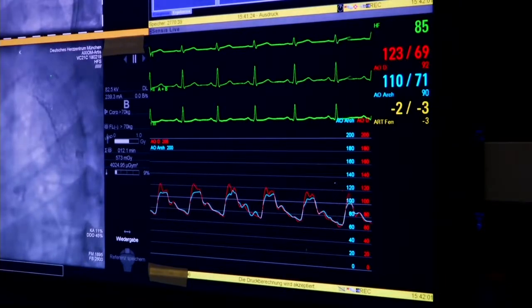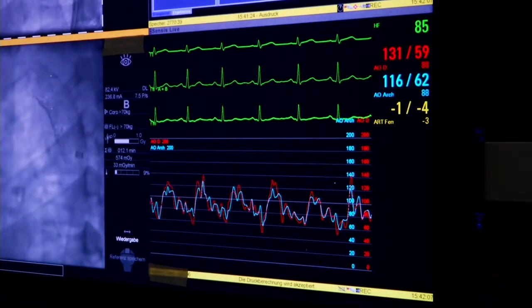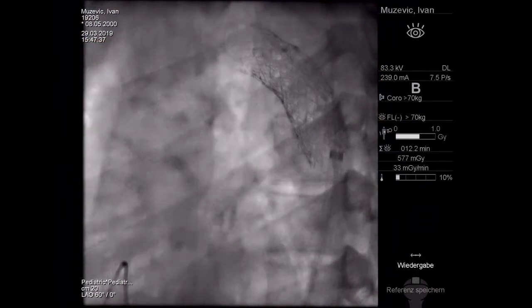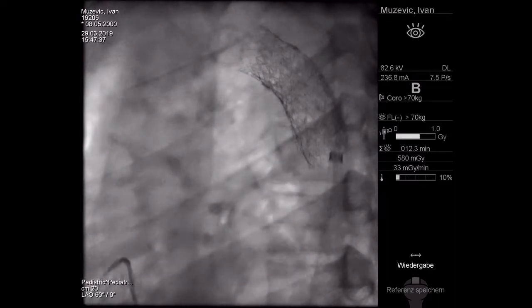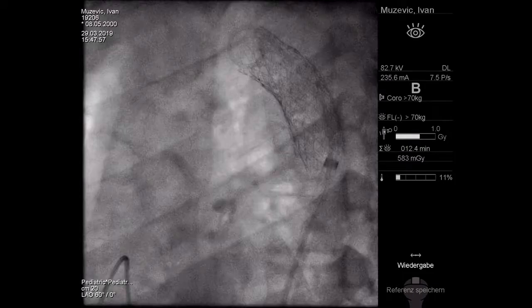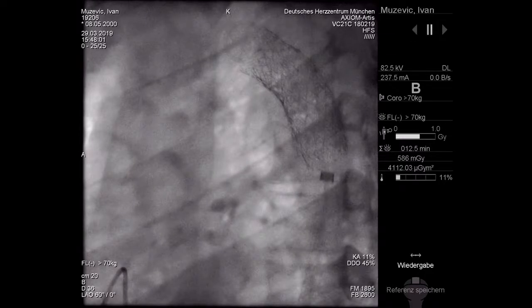I take a multi-purpose catheter and a 6 millimeter Powerflex. And may I ask the audience how many would work on the subclavian now versus leave it, since there was really good flow, and maybe measure arm blood pressure and see whether it's even necessary? Who would do the subclavian in this same procedure? Peter, do you have a Conquest balloon or something like that? Who would wait and do it later once the stents are healed? I need the Powerflex. We can't see it very clearly. 6 by 2 is good.